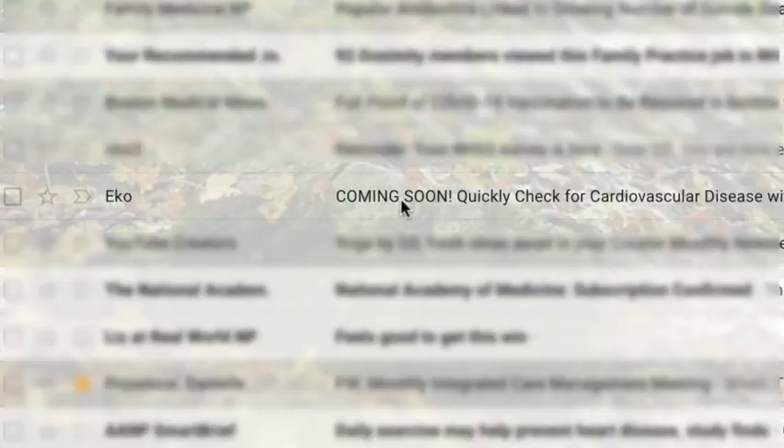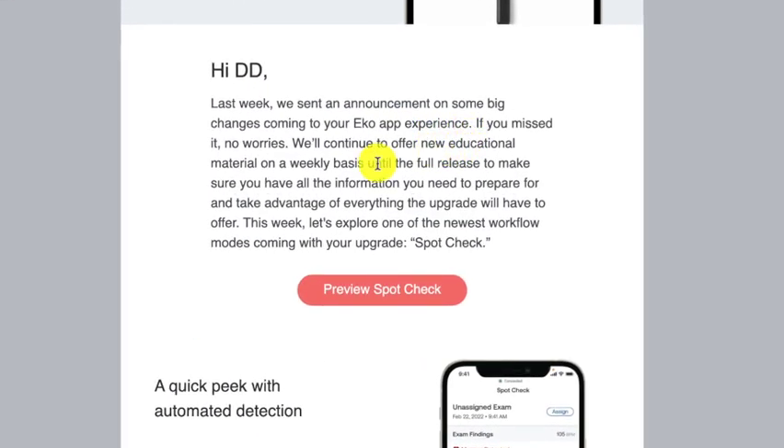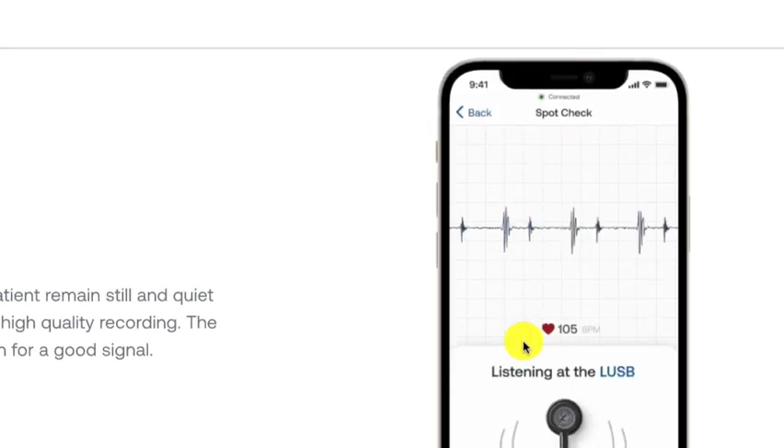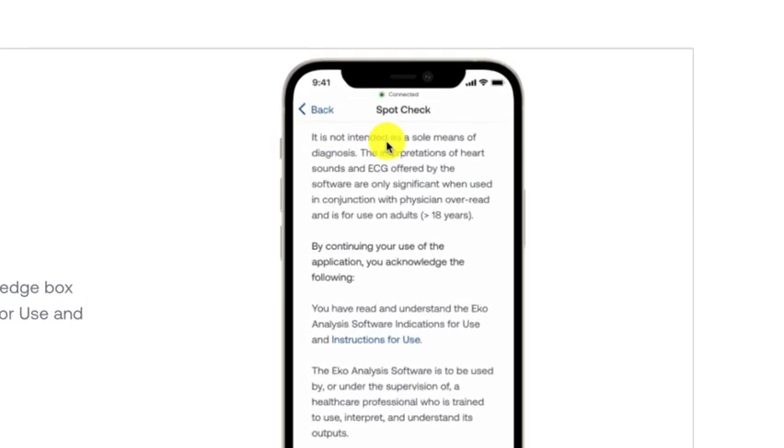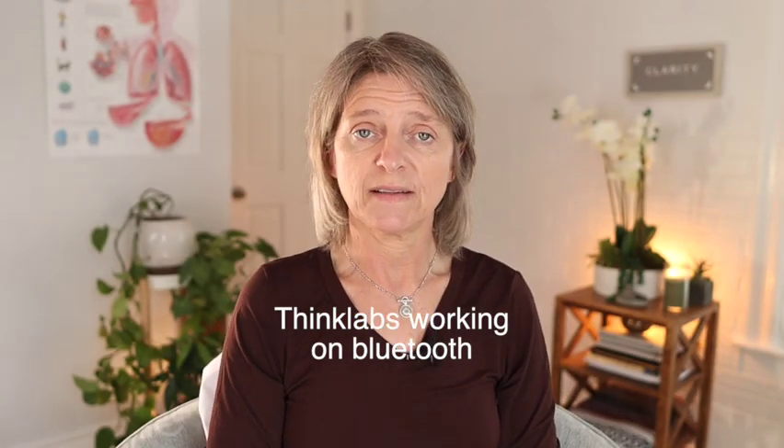The waveforms I'll rate include heart sounds, lung sounds, and EKG tracing. Just know this is as of March 1st, 2022, and always subject to change because technology advances every day. I recently got an email about new Eko features coming soon called Spot Check — I'll link that below. Thinklabs is also constantly advancing and looking at Bluetooth compatibility with different devices, hopefully including hearing aids.